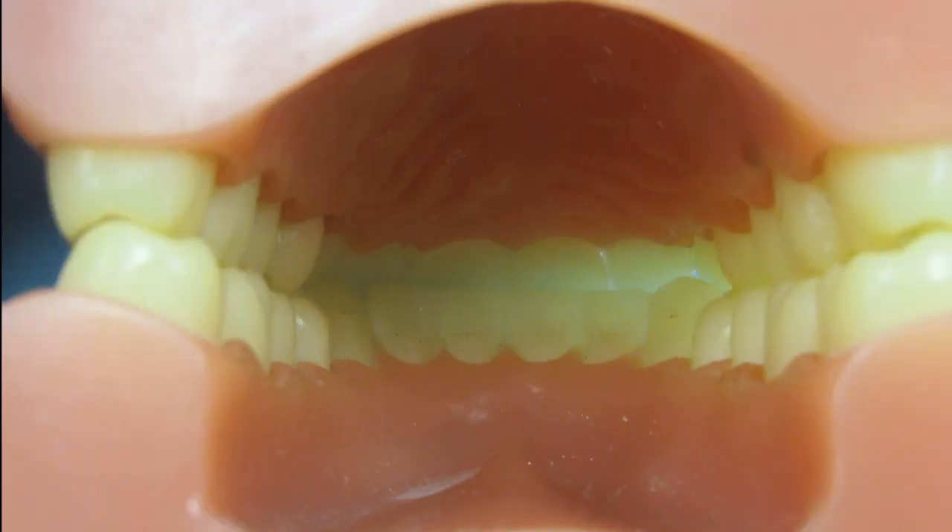Any time you need an upper fixed lingual bonded retainer fabricated, please send us a lower model so we can check the occlusion to make sure there are no interferences. We can fabricate the upper retainer more gingival if necessary so the lowers do not contact it. If the lowers do touch it, you run the risk of the patient knocking off the retainer.